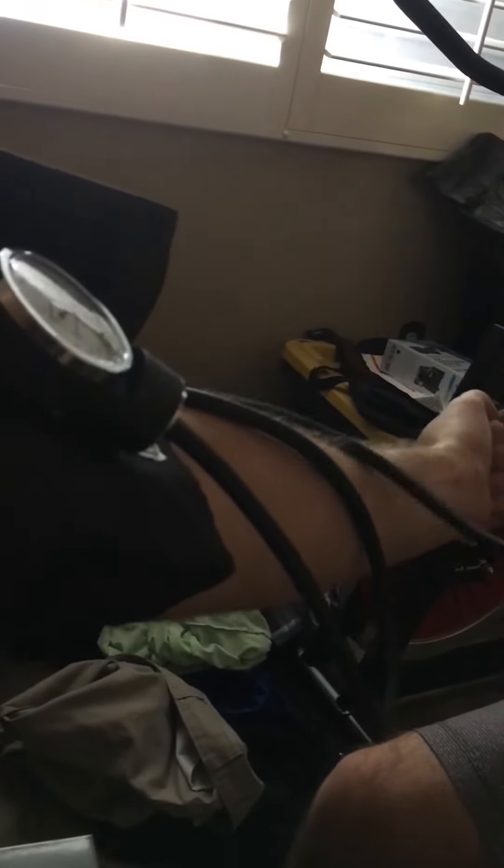For blood pressure, you're going to need a stethoscope and a blood pressure cuff. You're going to need to line it up on the arm on the artery — if I can see your left arm — and line up the left arm with the artery. Make sure the cuff is empty, then line up the stethoscope with the artery. You're going to want to listen for the first Korotkoff sound for the systolic blood pressure and the last Korotkoff sound for the diastolic blood pressure.